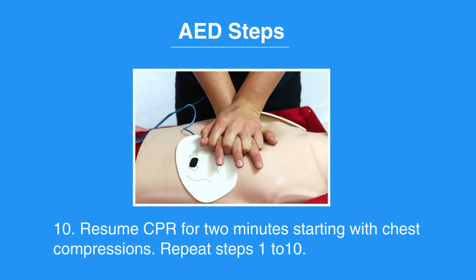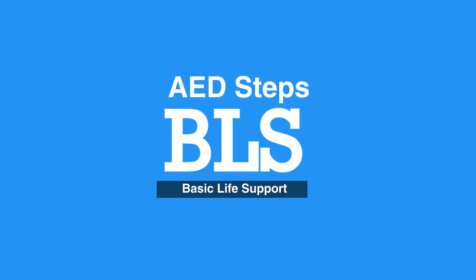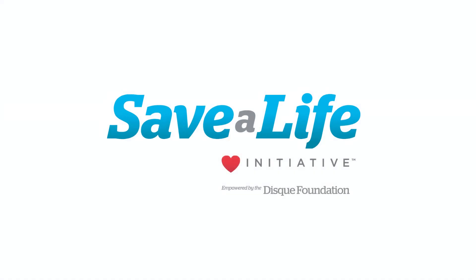Resume CPR for two minutes starting with chest compressions. Repeat steps one to ten. This concludes our lesson on AED steps. Next, we will review One Rescuer BLS for children.